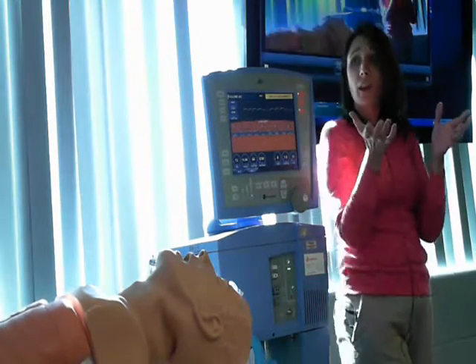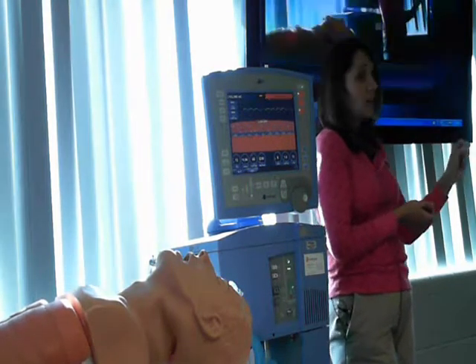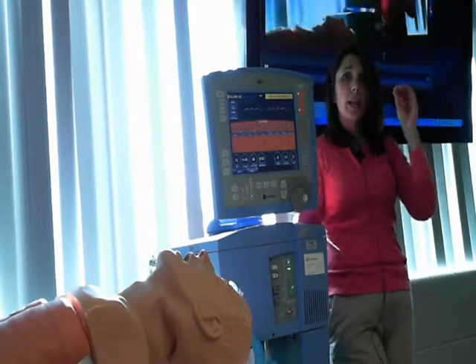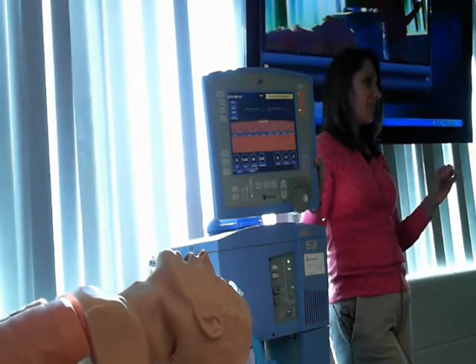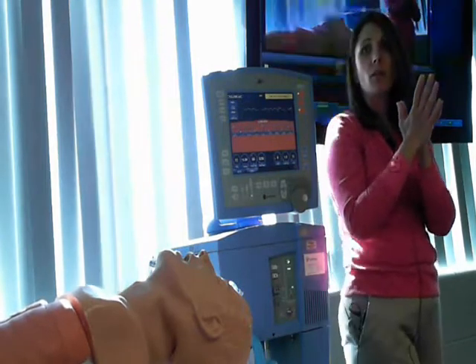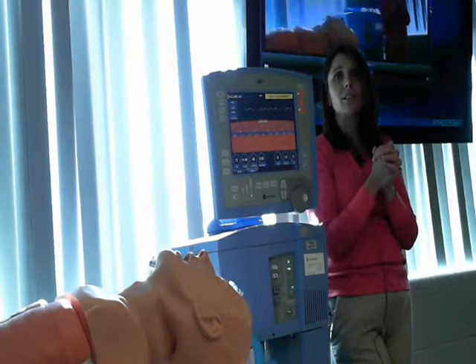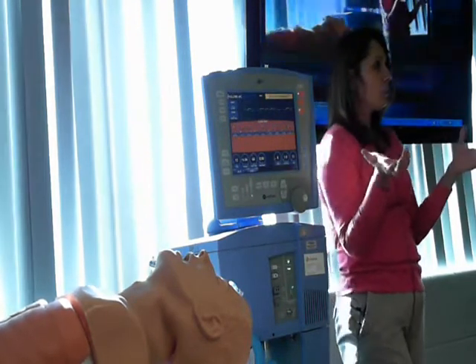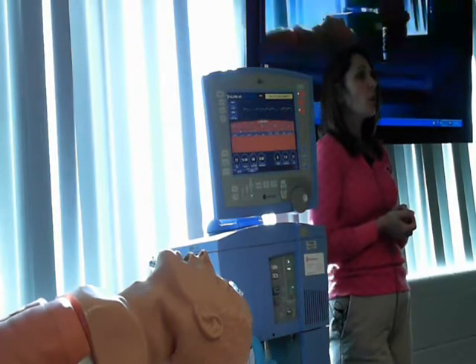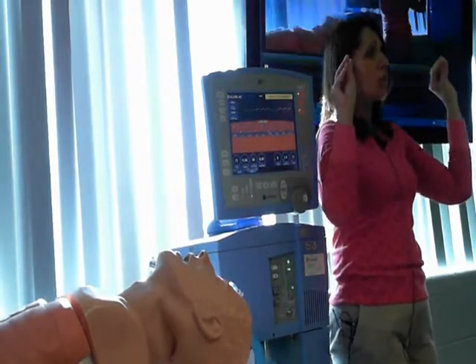So you have to be really careful if you have a patient with ARDS to make sure that the tidal volume is appropriate for their height as well as their disease process. Because imagine, we also set a respiratory rate. If I set it on 20 breaths per minute, which is normal, 20 times a minute, 24 hours a day, for however many days they're on the ventilator, I am doing what you felt with your hands. What do you think that does to the lungs' ability to exchange gas into the teeny tiny capillaries? It decreases diffusion greatly. And what is very frightening with ARDS is if we are doing that, your patient can have chronic lung disease afterward. Okay? So I share that with you, A, because it's a disease process you're learning about, and B, because sometimes when you feel something, it makes you remember it, okay?